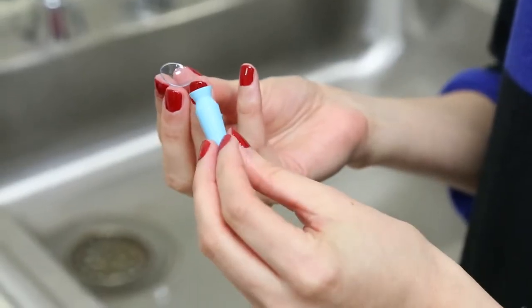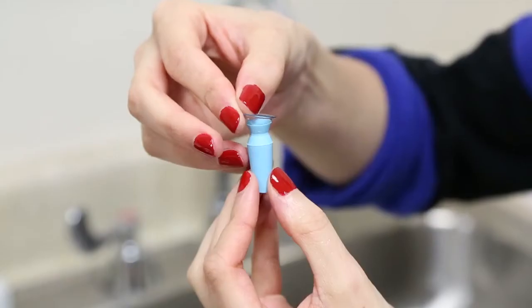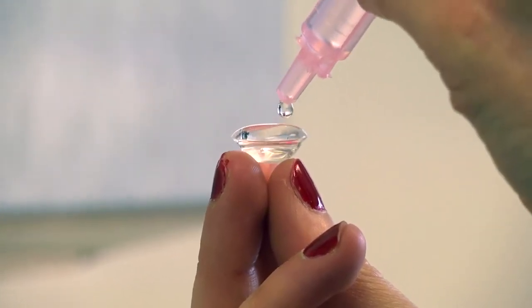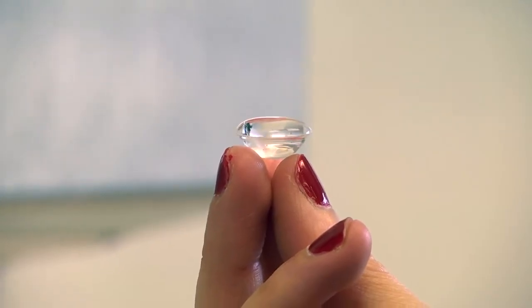Position the lens on either of these insertion tools. You may use a tripod of fingers, or you may use a large plunger to balance the lens. Fill the bowl of the lens with saline so that it is filled all the way to the top and forms a bubble-like appearance at the top.